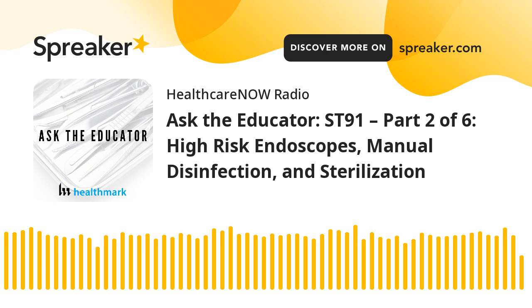But again, keep in mind your logistics and workflow. Do you have enough scopes to account for that longer turnaround time with them being sterilized and going back and forth between departments? How are your procedures scheduled? There's a lot to think about when you're moving to sterilization. So increments is what I recommend: low-hanging fruit, what's already sterilizable, and start there.